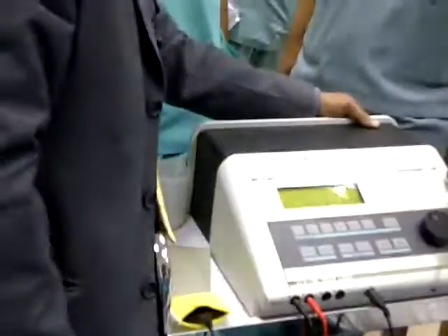So once the treatment is over, stop, go to menu, switch off. Say goodbye.